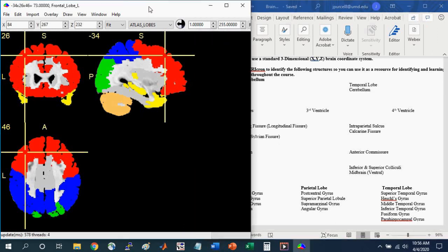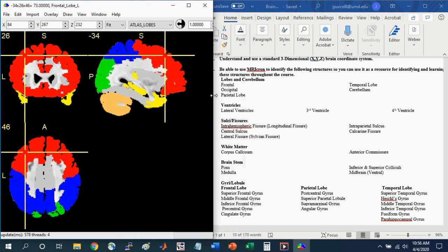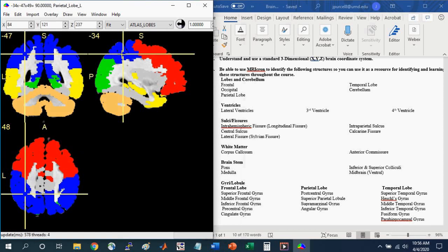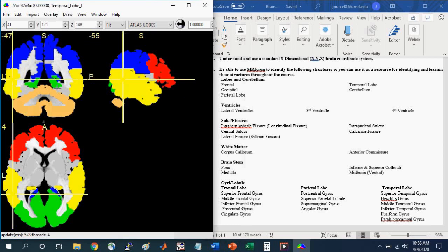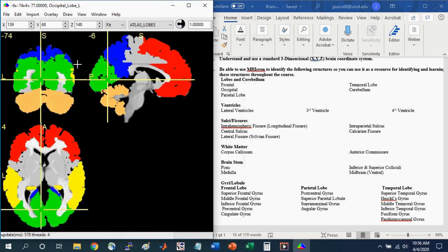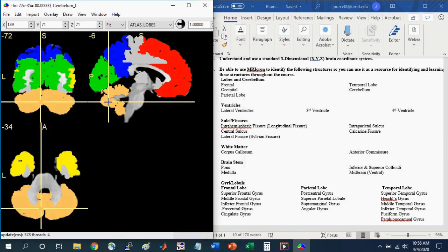Up here at the top, you see that we focused on the lobes and the cerebellum. Here in the MRI Cron window, you can see by just clicking on the colored region, you can identify these different structures. Clicking on the red, you can identify the frontal lobe. Clicking on the blue, you can identify the parietal lobe. Clicking on the yellow, you can identify the temporal lobe. Clicking on the green, you can identify the occipital lobe. And finally clicking here on the tan, you can identify the cerebellum.